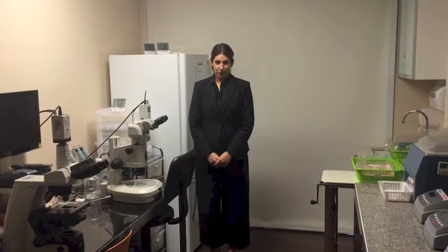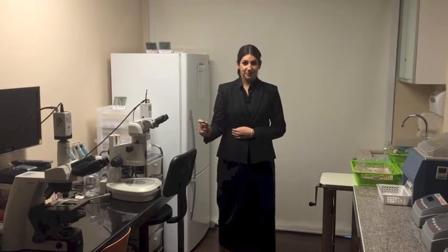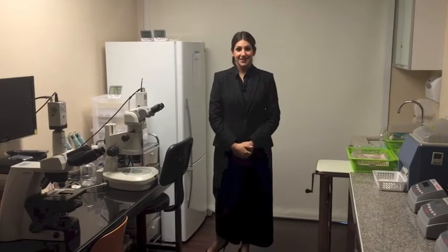Welcome to the genetic lab, which is located on the second floor of the building. After receiving the cell biopsy, the scientist uses the stereo microscope for fixing the cell. Then they use a phase contrast microscope to check for the nuclear on the slide. Then the thing is transferred to the thermobrite, which is used for the hybridization. Finally, the fluorescent microscope is used to find the result of the embryo, or also known as the genetic screening.